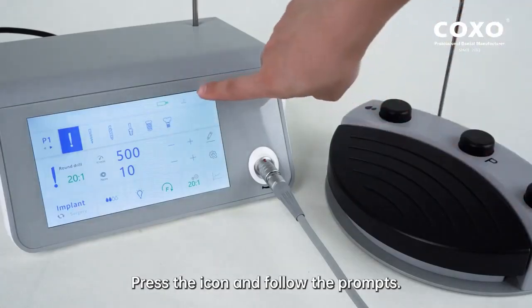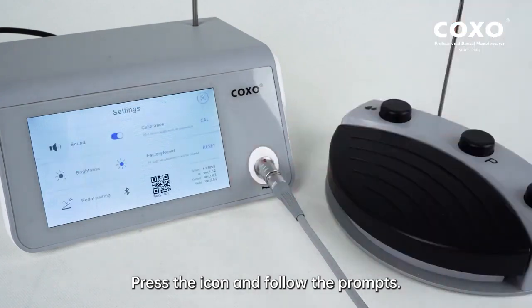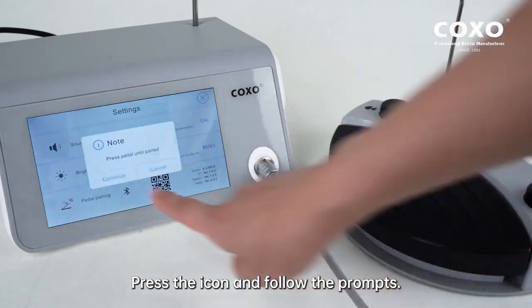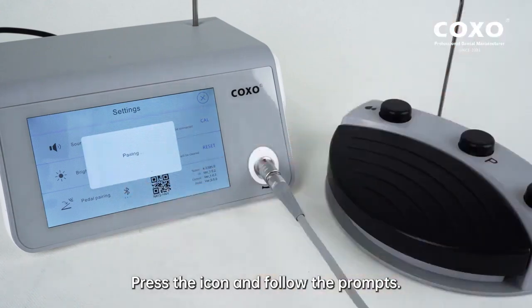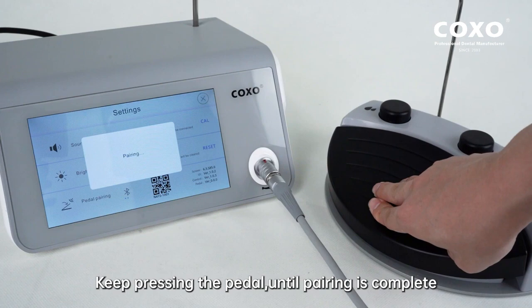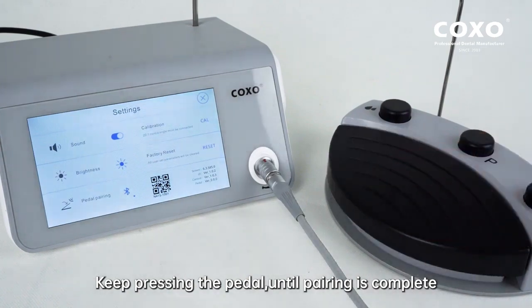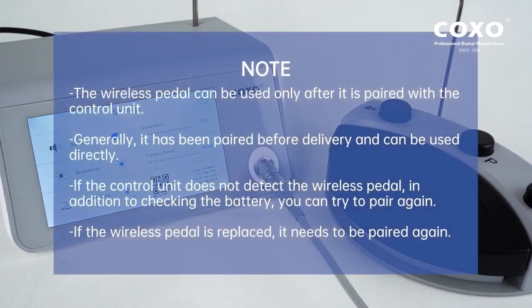Press the icon and follow the prompts. Keep pressing the pedal until pairing is complete. The wireless pedal can be used only after it is paired with the control unit. Generally, it has been paired before delivery and can be used directly.